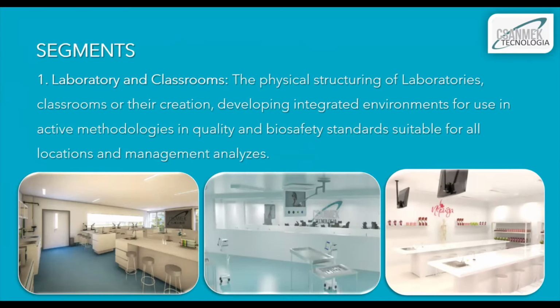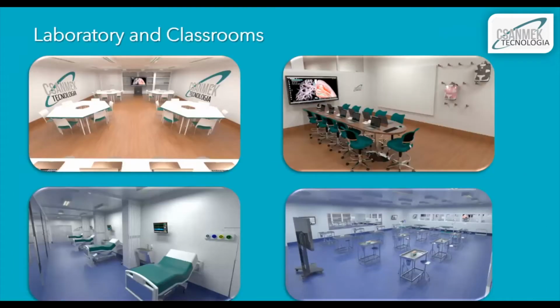Our software is integrated with the backend of the hospital. So all the database of patients can be integrated with the platform, and you can easily translate and rebuild the hospital database to the platform and transform that into a teaching environment or even into a planning environment, and we will show that soon.